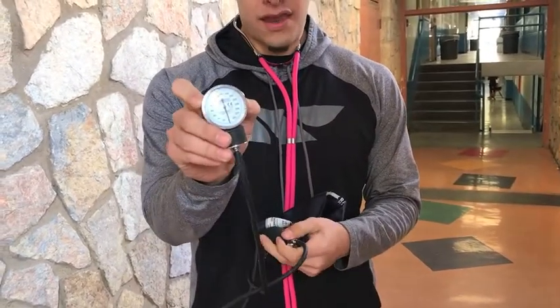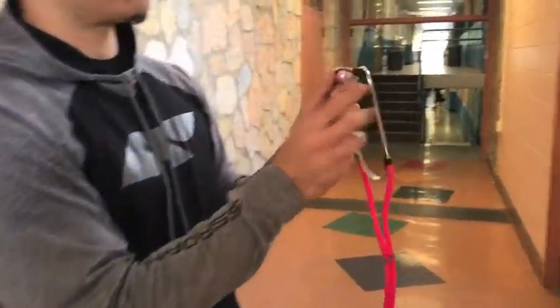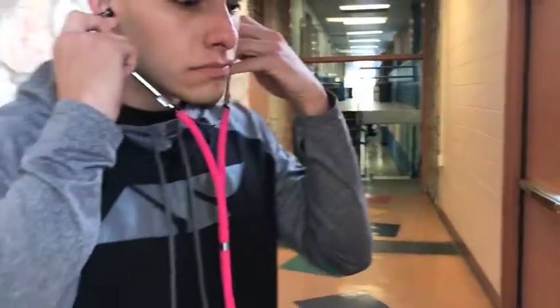Make sure the earbuds of the stethoscope are pointing forward to ensure quality sound from the brachial artery. Lightly tap on the diaphragm to test for clear noise.